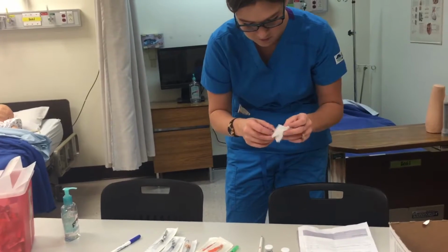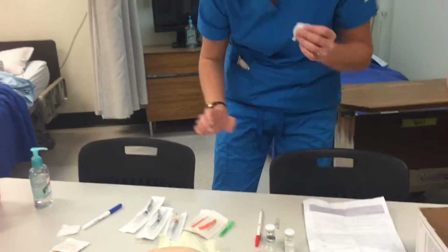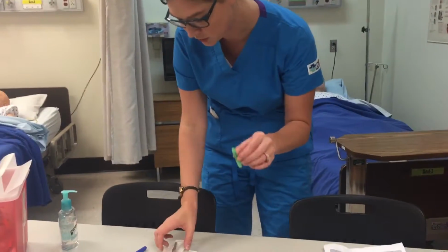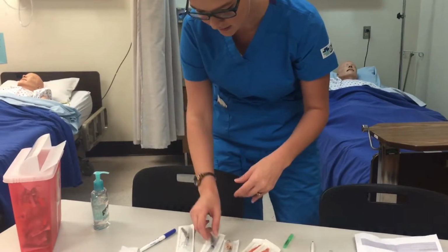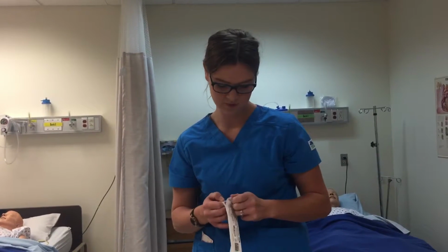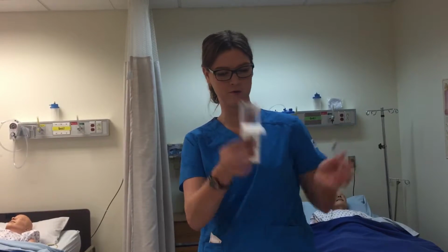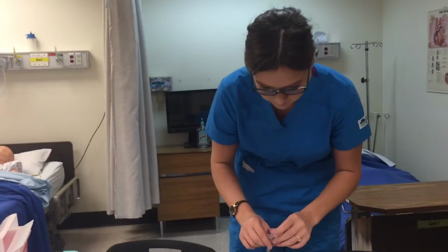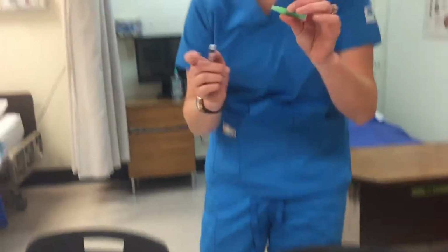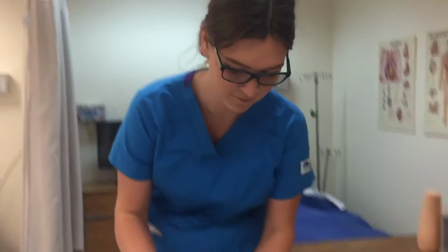So I'm going to use my 2x2, and I'm going to break the glass neck away from me. And then I'm going to put this in the sharps container. So since this is a glass ampule, I'm going to need a filtered needle to filter in case any glass was pulled. So I'm going to open it this way, touching the plunger. I'm going to remove the syringe, or not the syringe, the needle, I'll use that later. So I'm going to open my filter needle, put it on the syringe, open it, and draw.